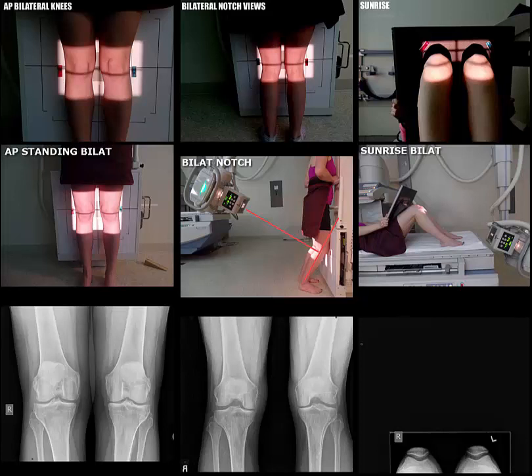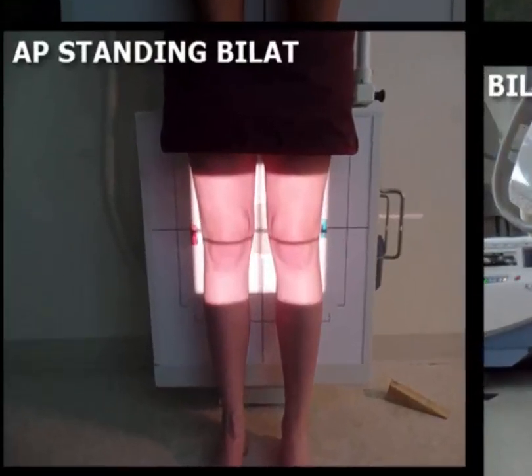In this video, we are going to look at a few more projections of the knees. First, let's start off with AP bilateral knees. These are done standing. Prior to having the patient up against the upright bucky, please ensure the patient has removed both their shoes and their socks.